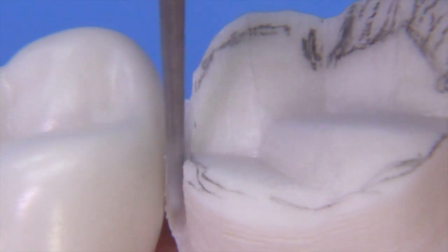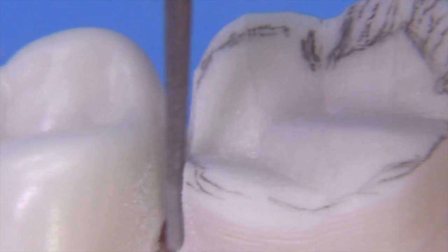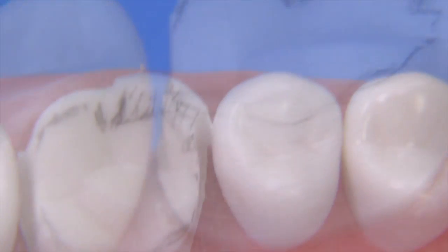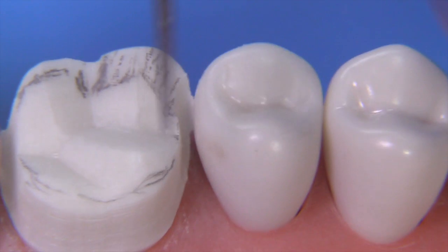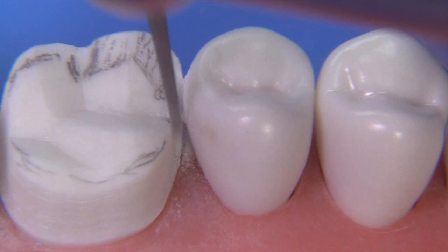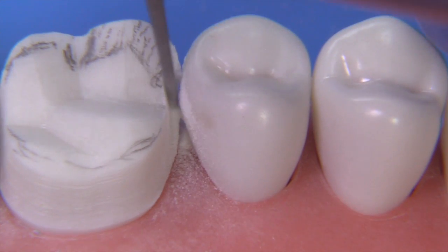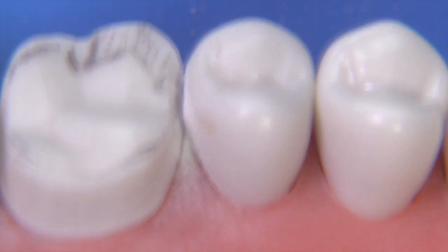Notice the shell protecting the adjacent tooth. The needle-shaped burr is about as small as you can get in dentistry, so if you have a very thin shell — less than a tenth of a millimeter — and you're using the burr straight up and down, you're not making any errors. Sometimes people worry they're going too deep axially and end up hitting the adjacent tooth — be careful about that. The mesial side is going to flare out at an angle — not like an amalgam exit angle, but more like a composite or gold inlay exit angle. For a gold onlay, three-quarter crown, or seven-eighths crown, it's about 90 degrees plus 45, forming an obtuse angle of 135 degrees relative to the axial wall.